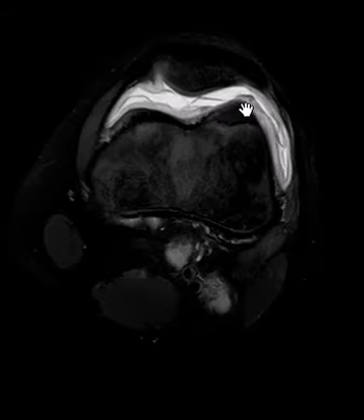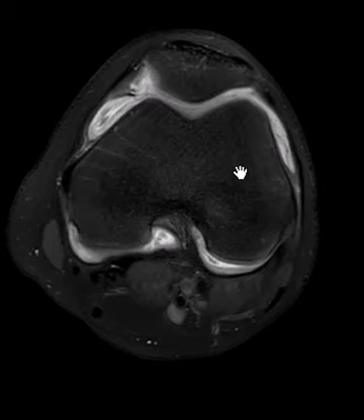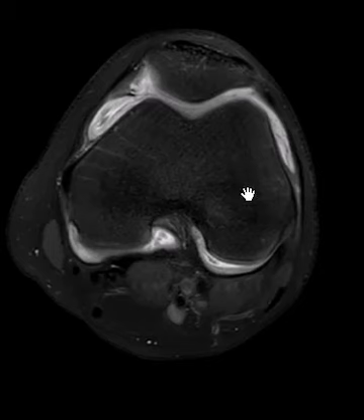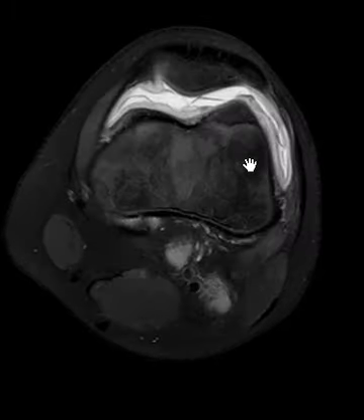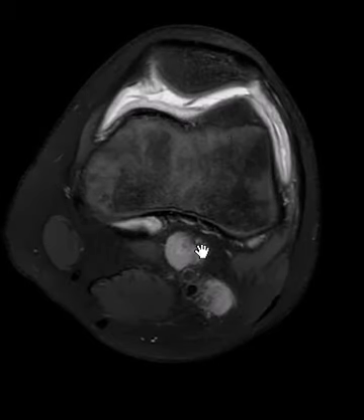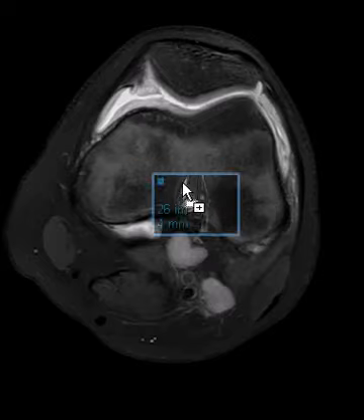This is behind the kneecap. On this view you can see this gray line — this is the synovium, the synovial lining that's diffusely thickened — and the clear white stuff is the fluid within the knee joint. So this patient has synovitis of undetermined etiology. Typically when we see this we think there may be an infection, and so the orthopedic surgeon needs to aspirate and test the fluid to see if it's infectious.